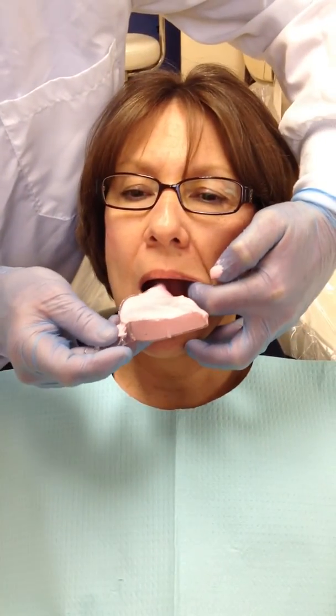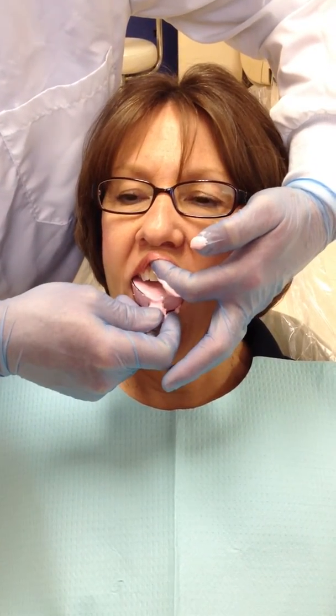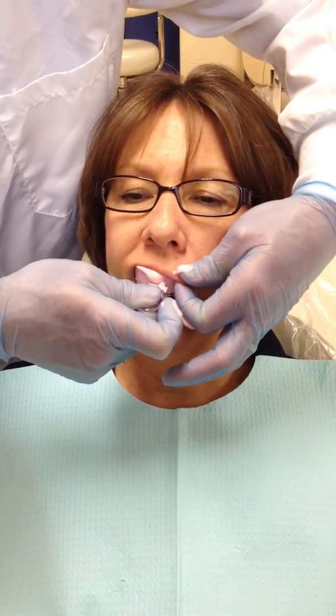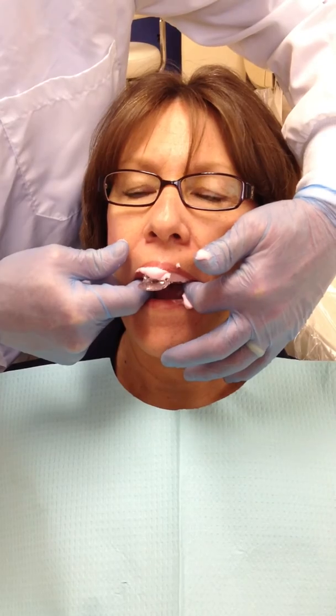We will take this to our patient. Standing behind, we will retract her lip. Insert the tray, making sure we have it posteriorly seated — seated posteriorly first and then roll it up toward the front, releasing her lip and holding it into place.